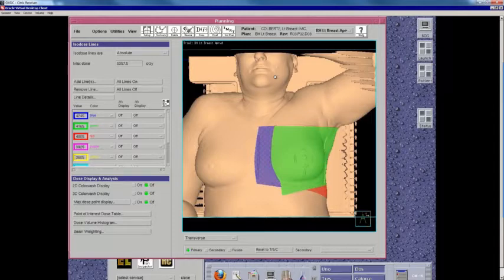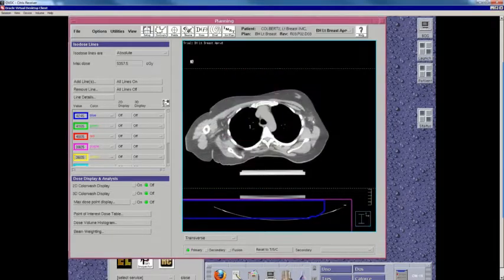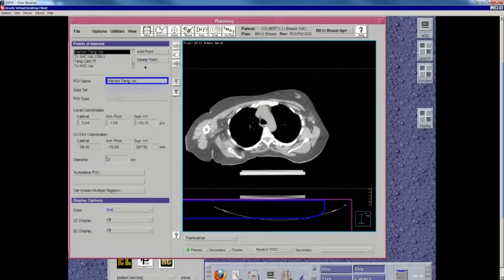So that's what I do before I simulate a patient, and then we simulate the patient, and we'll place setup marks on the patient. Should we talk about how we set patients up? So what we do in our practice, and we actually have one of our physicists on the phone call as well, so if I start to veer off course and say the wrong things, he can correct me.